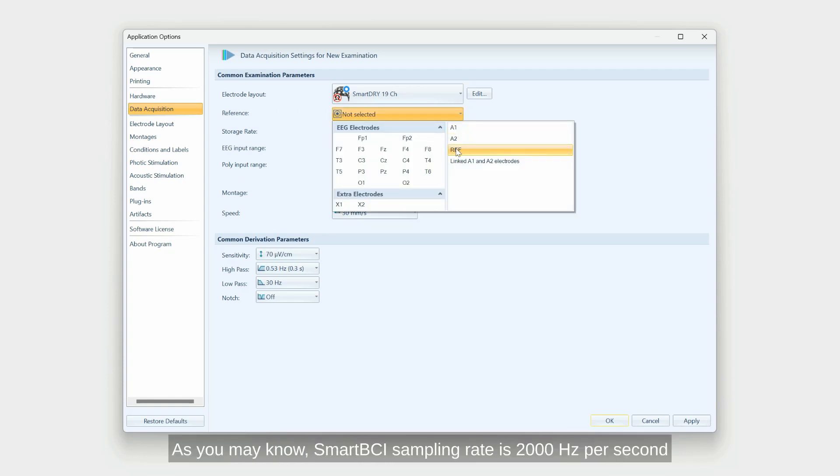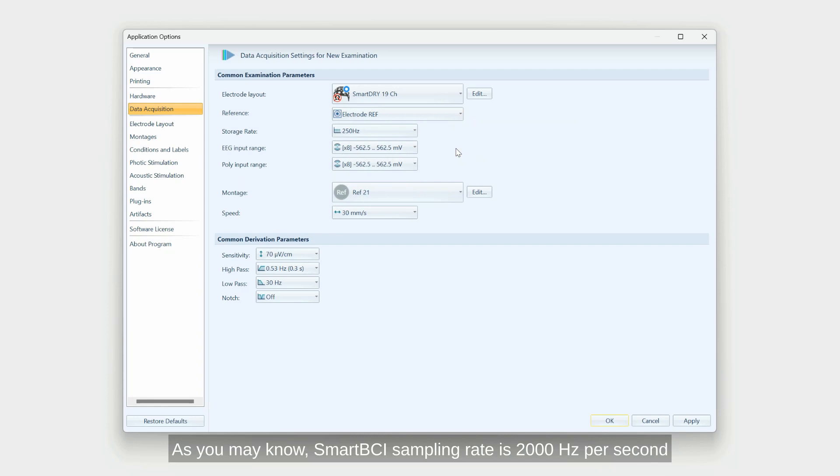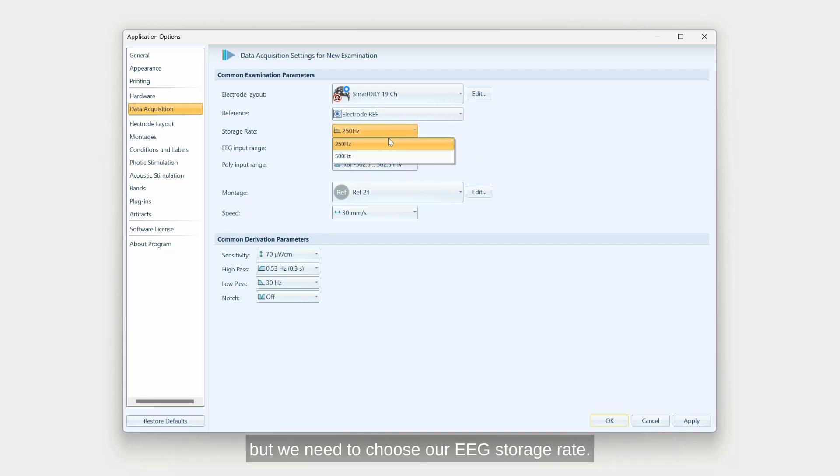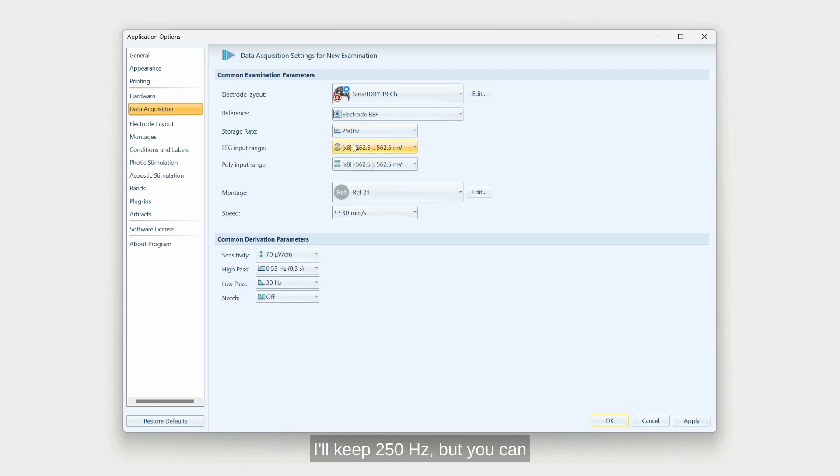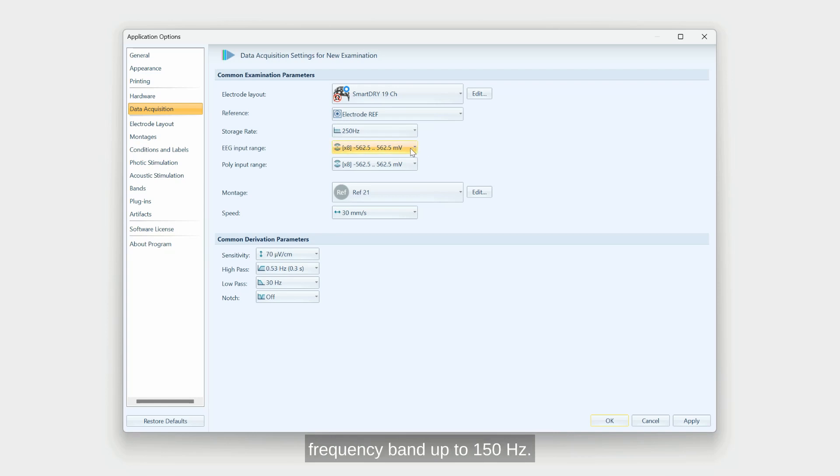As you may know, SmartBCI sampling rate is 2000 Hz per second, but we need to choose our EEG storage rate. I'll keep 250 Hz, but you can switch to 500 Hz if you want frequency band up to 150 Hz.